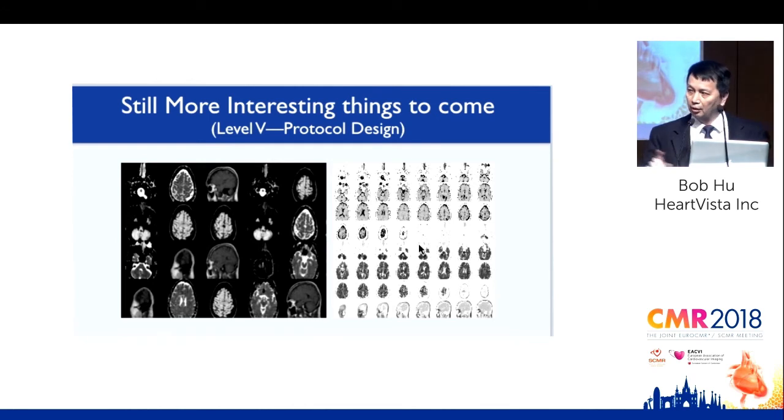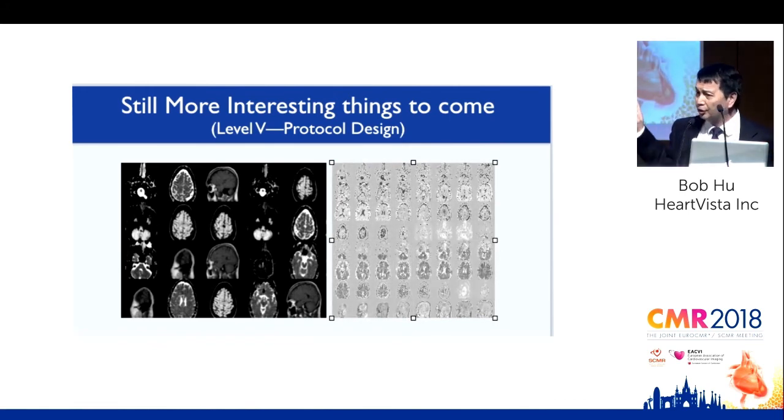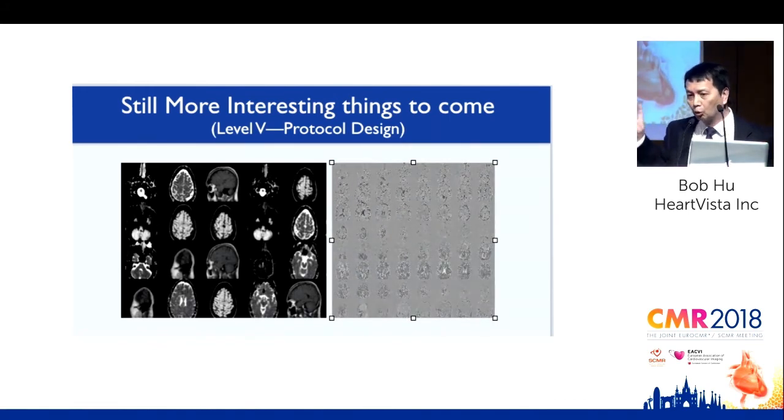What we have here on the right-hand side is a set of test data images, embedded in which are a couple of abnormal slices that the machine has never seen before and has never been trained for. In the very beginning of this video, I'm going to show you data with a network that's not yet been trained. But as the slide plays, we're going to gradually train the machine to recognize normals.